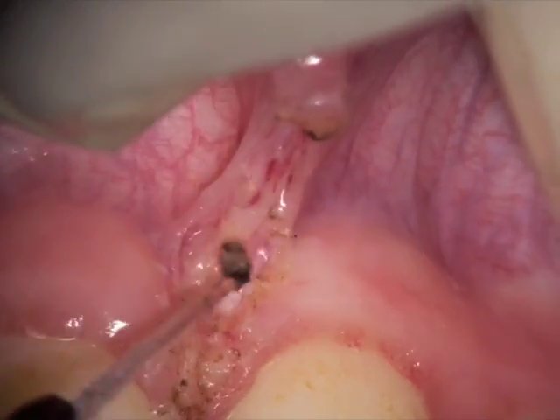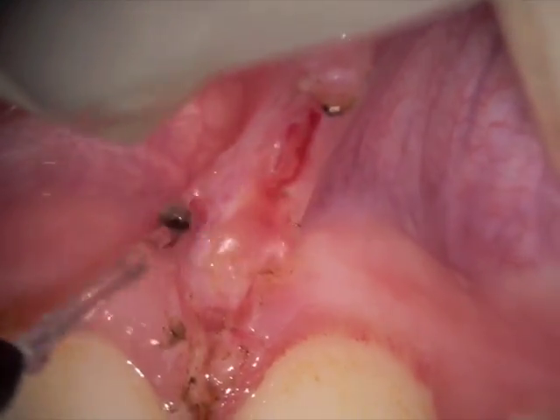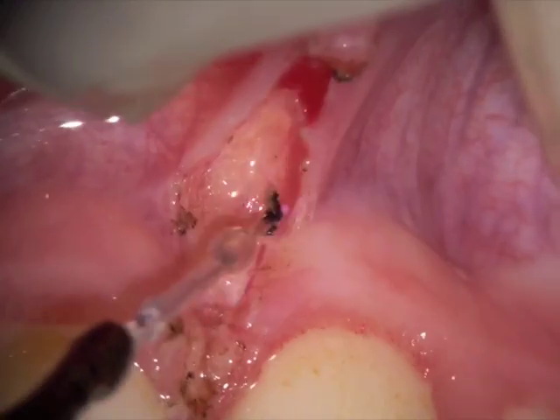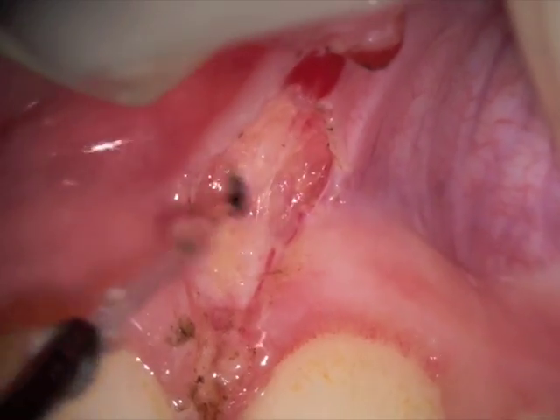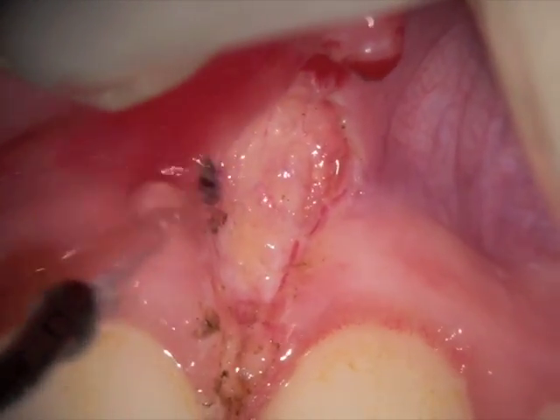I'm basically cutting at both first and third base on this diamond, gradually creating a wider and wider shape. As I'm using the diode under the microscope, I'm able to see where there are still fibers attached. You can see the water is preventing any charring from happening, and periodically a little bit of accumulation of coagulant on the tip.